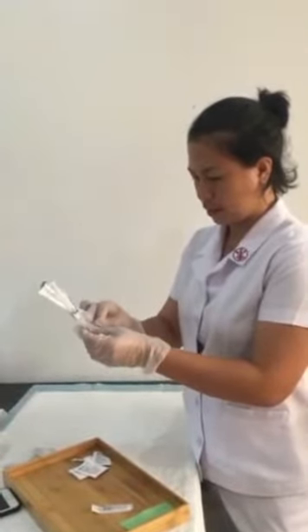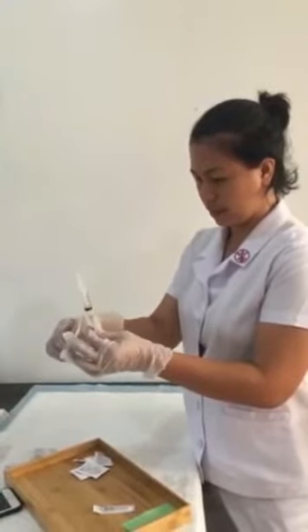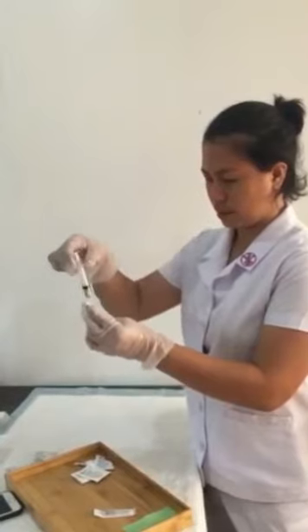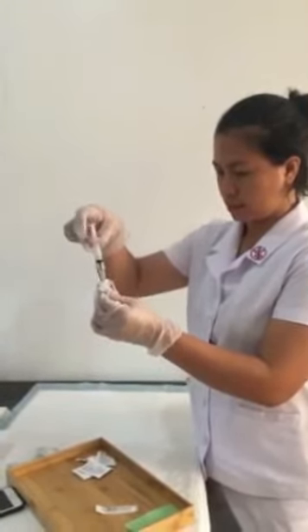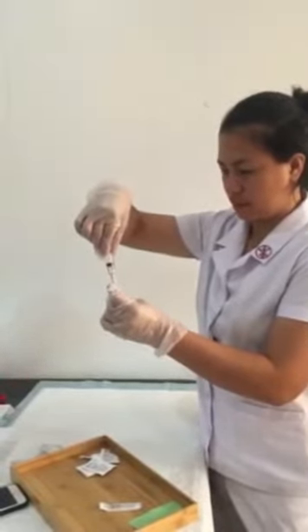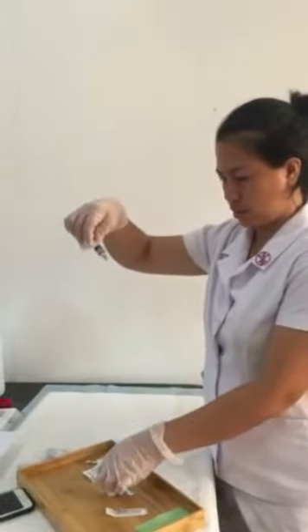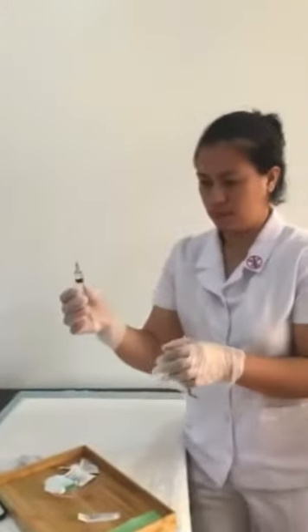Prepares the syringe for injection. Remove the needle cover and discard without contaminating the needle. If using a pre-filled unit dose medication, take caution to avoid dripping medication on the needle prior to injection. If this does occur, wipe the medication off the needle with a sterile gauze. Some sources recommend changing the needle if possible. Medication left on the needle can cause pain when it's tracked through the subcutaneous tissue.